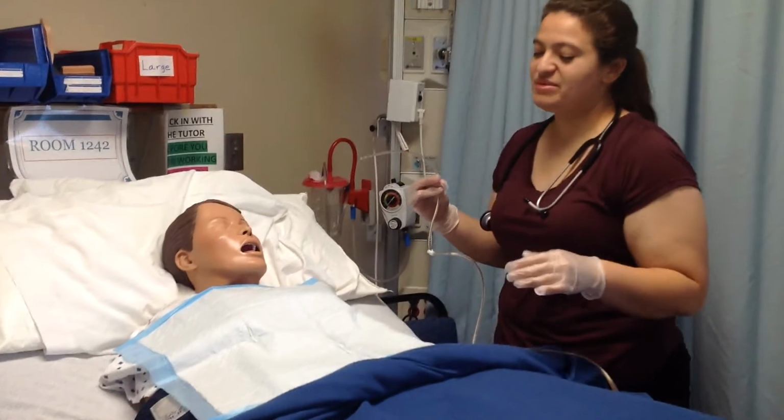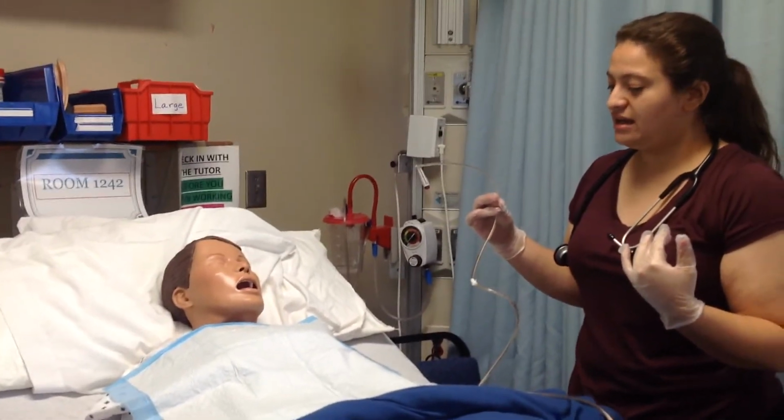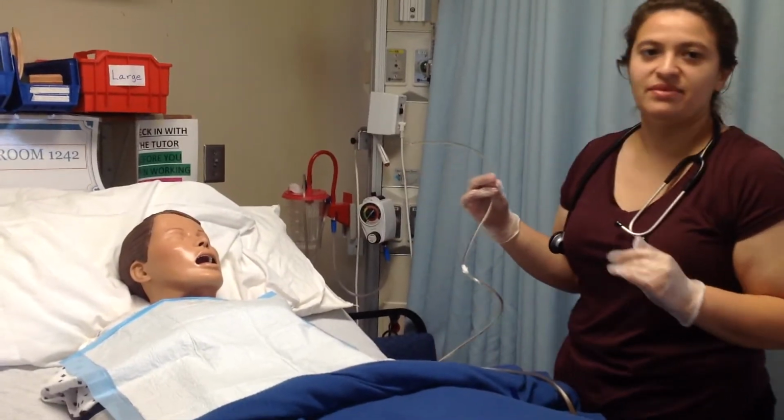And then I would explain to the patient that the blue pad is supposed to help with any fluid or just anything that might get his gown dirty, so it's just to protect him.